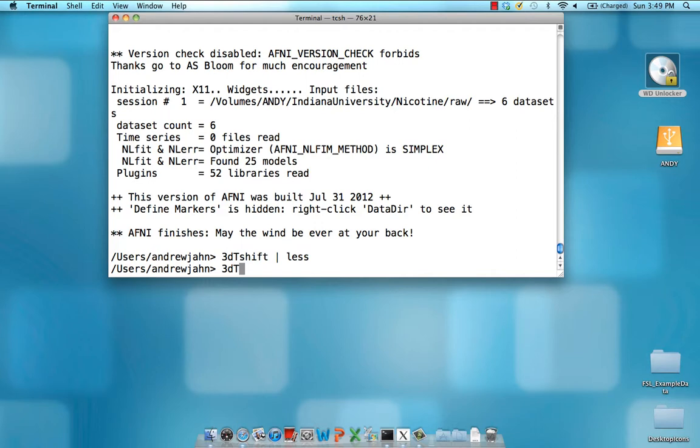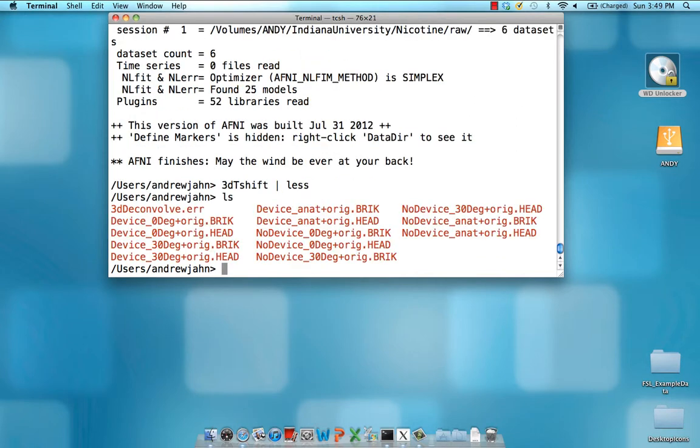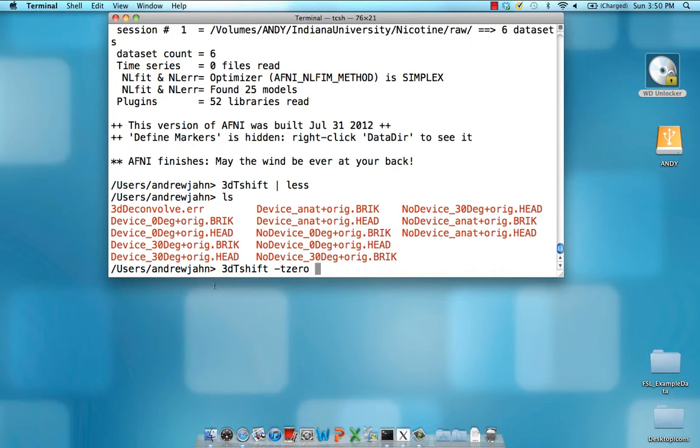Okay, so let me see what I have here. I am going to be working with this device underscore zero degree data set. So my full command is going to be 3DTShift. The slice I want to align to, or T-zero, is going to be the very first slice here. The T-pattern, or the acquisition pattern, is going to be ALT-plus.